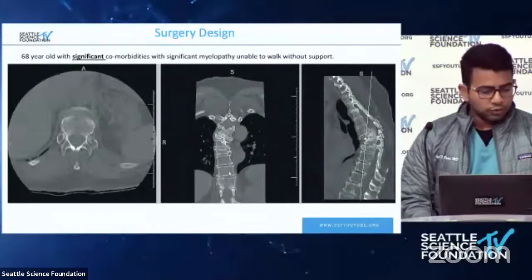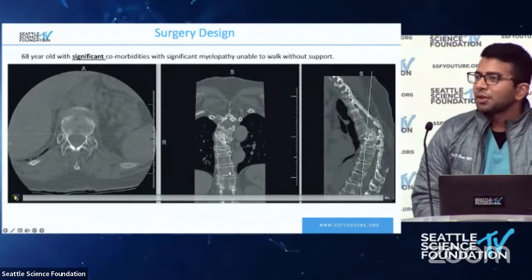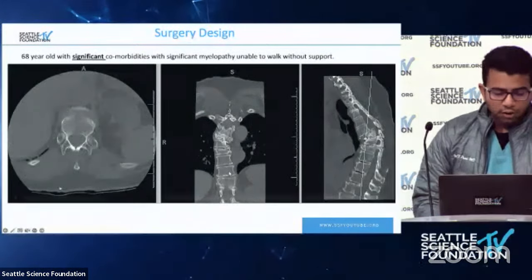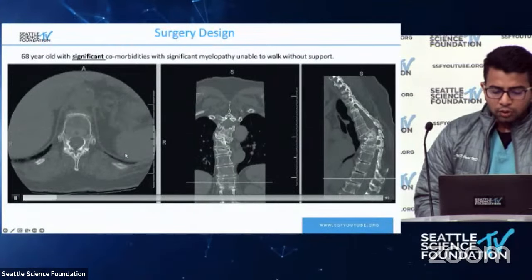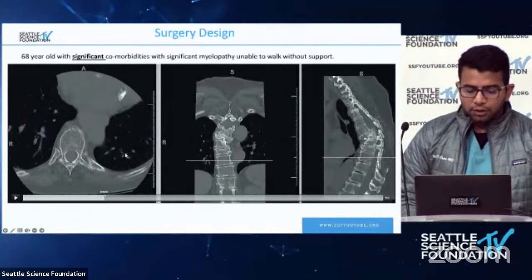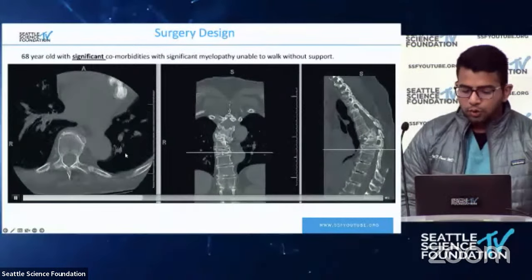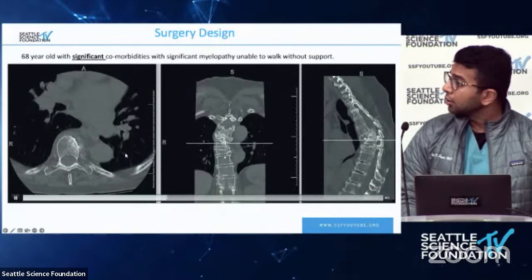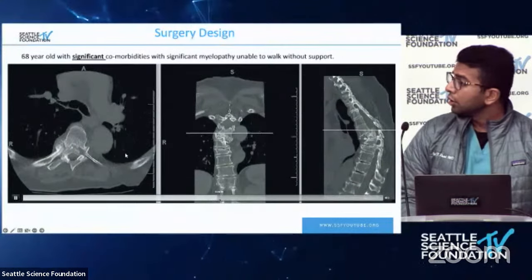Great points, Neil. Cool. Take us forward. Exactly what we considered and did as well. Some of the things that we noted were that pedicles were pretty thin at all levels. We did three levels above and three levels below. There was a compression fracture at the T9 as well. This is T7 vertebra plana, but T9 was compressed as well, at least starting to.